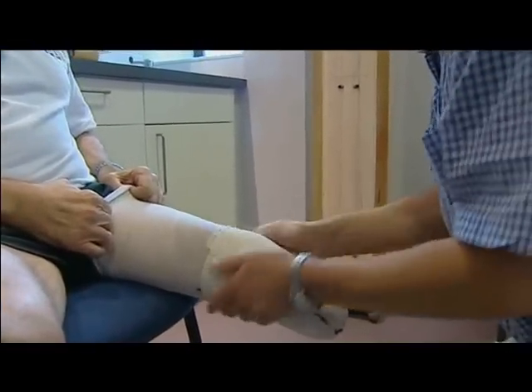Generally, prosthetists and how amputees have been fitted with prosthetic sockets depends on the experience of the prosthetist and also the confidence that the amputee has in the prosthetist. That's why one in four prosthetic sockets go into the bucket every day.